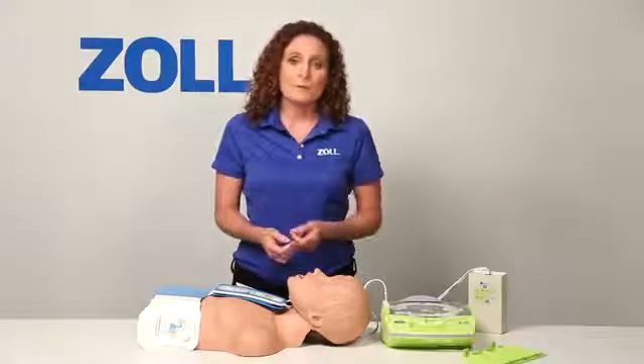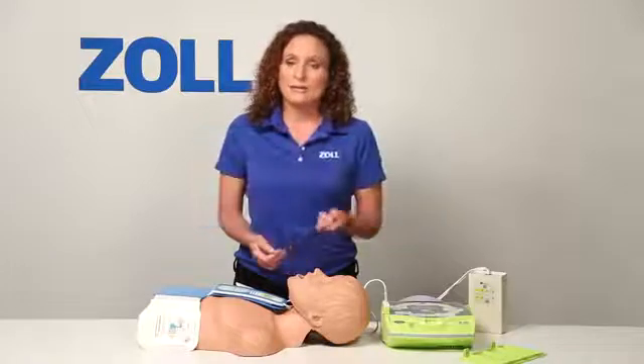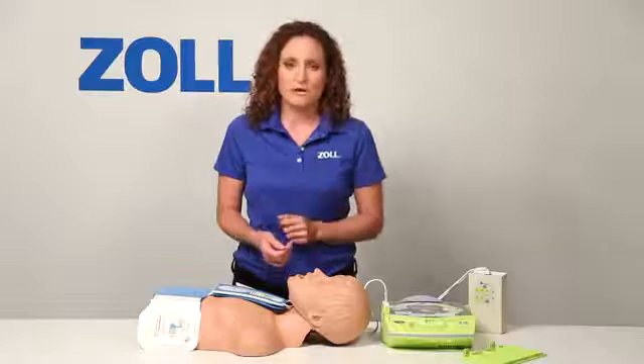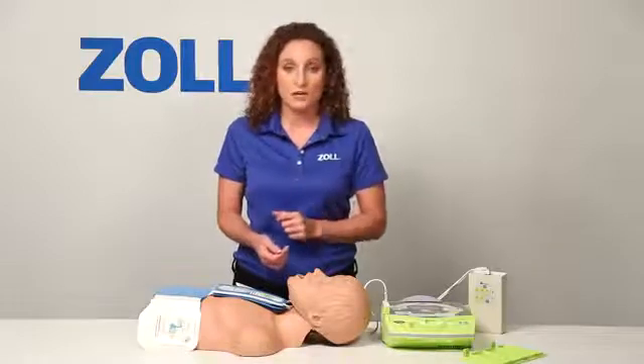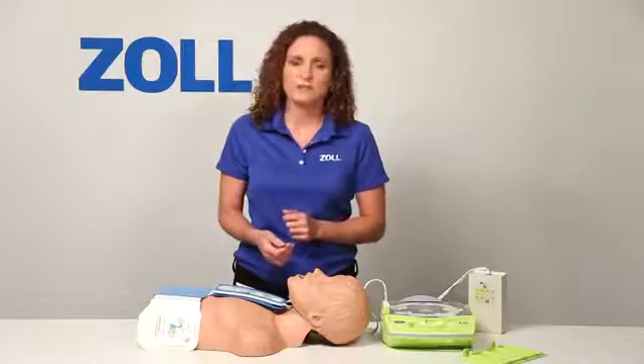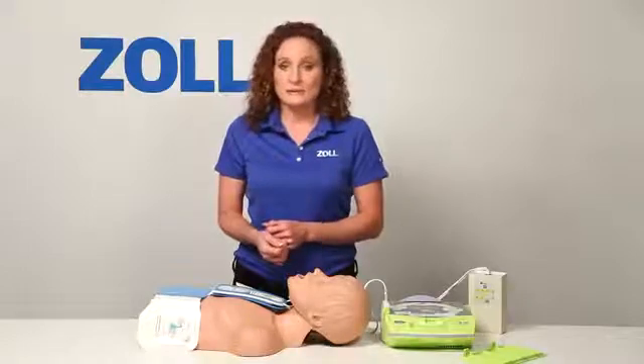As you can see, purchasing the AED Plus gives you real CPR help, the lowest total cost of ownership, and it helps in every rescue — not just half the time when a shock is advised. Your rescuers deserve all the support that they can get in every rescue, and that's why they need the AED Plus.